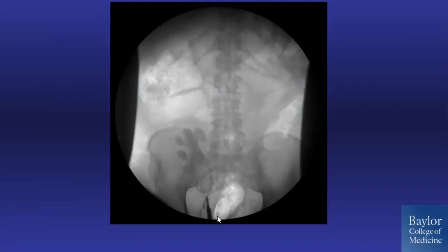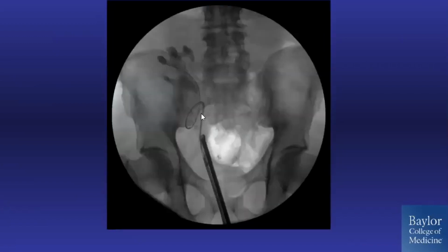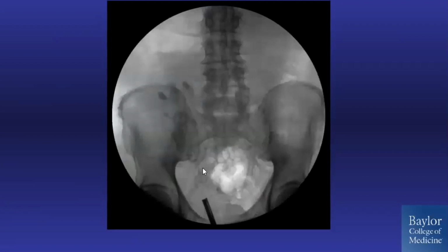And so these types of stents can just be exceptionally challenging to place, but the key is same principles. Get that rigid scope right up to the orifice to help you with the backing. Don't let any bowing in the bladder. And ultimately you can navigate this so that you can get the stent to make that coil up in the kidney. You can use multi-coil stents if you see something like this to position one of the coils in that location.